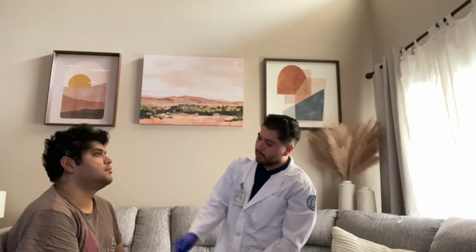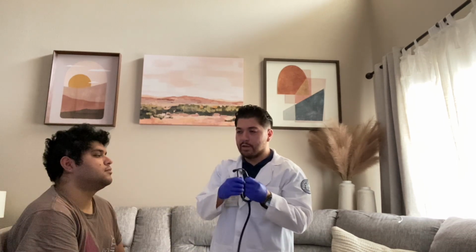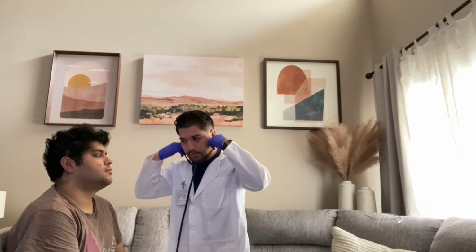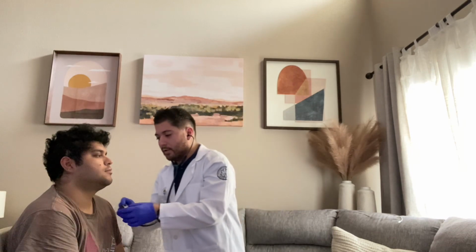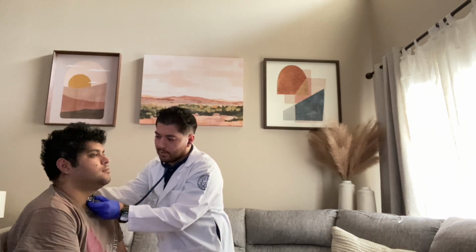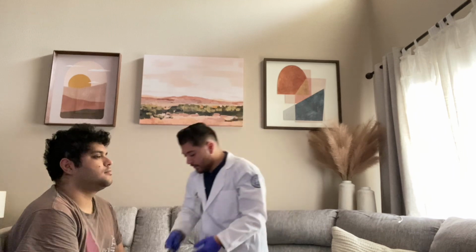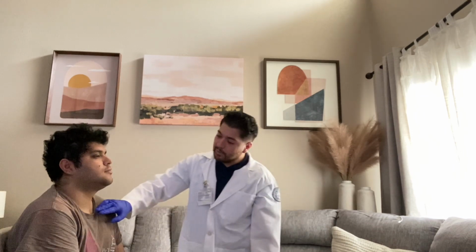Now we're going to be examining the trachea. We look for any deviation abnormalities. We're going to use our stethoscope and listen for any stridor. Can you take a deep breath, please? Okay, everything sounds normal. Now we're going to look at the thyroid gland.